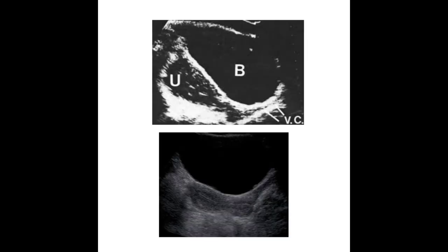But of course, we always have to learn about what early ultrasound systems were so we can kind of see where we've gotten to. And way back when ultrasound systems started, the displays were considered bistable. And now we've heard this term before. We talked about it when we were talking about pixels, the bistable meaning it could be on or off, black or white. And that's the same idea with those old ultrasound system displays. If they were bistable, they could only display black and white pictures. No grays, just black or white.